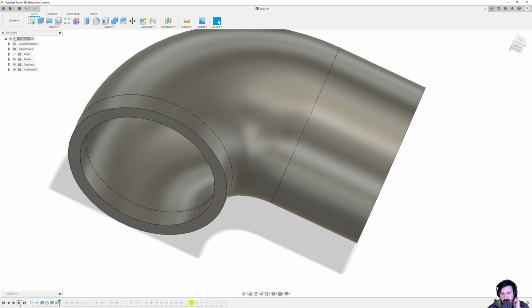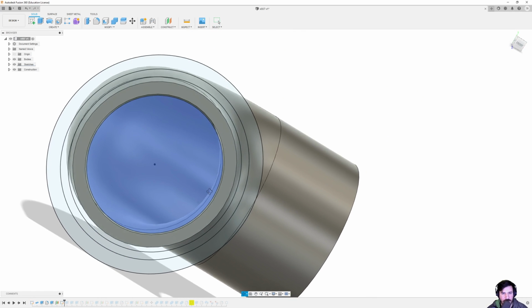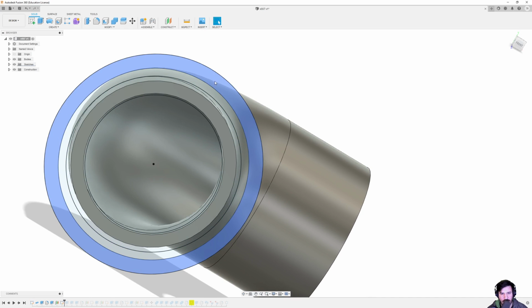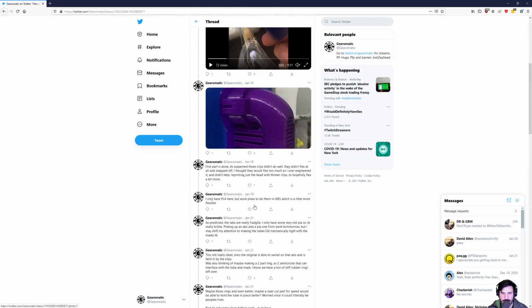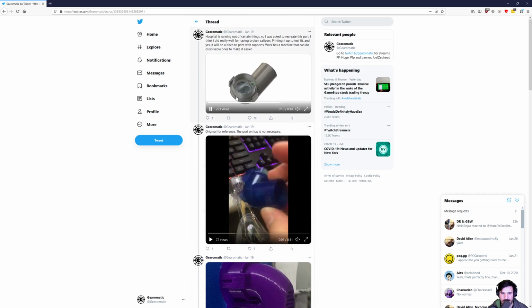So I can draw on this face here, and you can see what I drew. The outside lip here, which became, I don't have a really good picture of that. Let's see. No, I don't. It became this. Let's see. It became this rim right here.